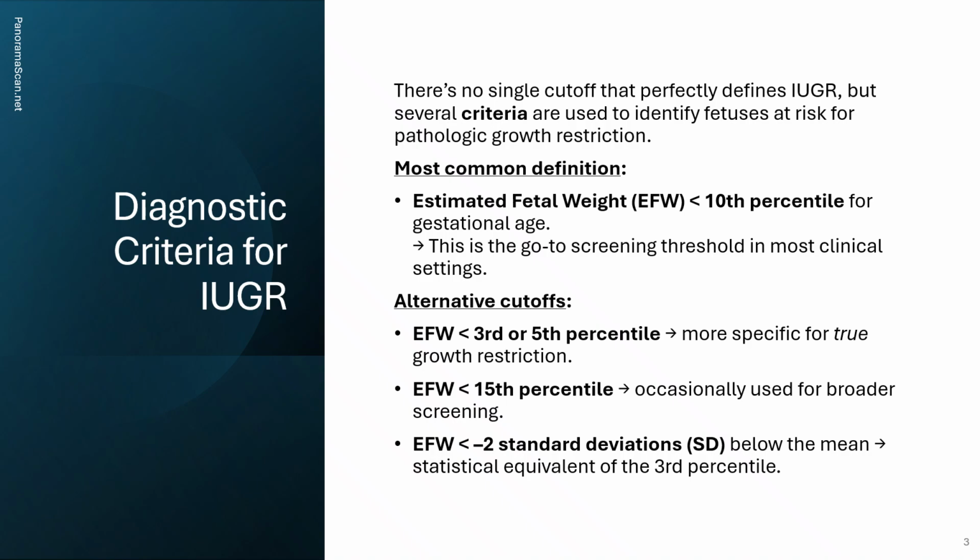Always interpret these cutoffs in context with trends, Doppler studies, and clinical findings. Percentiles are just the starting point. The full picture is what guides management.